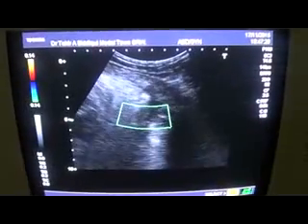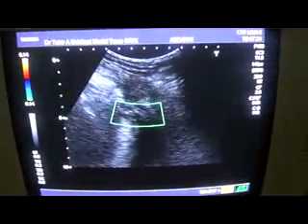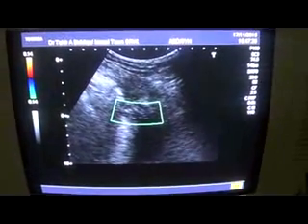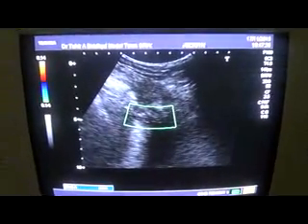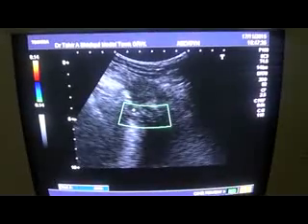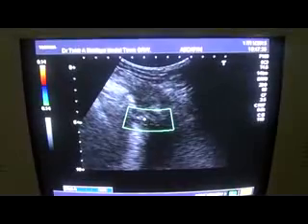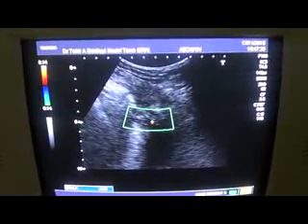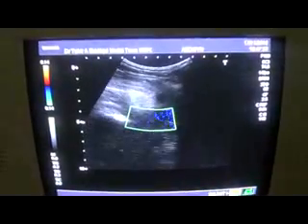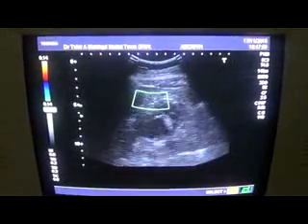We do not see any flow within these tubular structures, and thus this is in fact, again I am going to repeat, this tubular structure is the implanted ureter, and it is full of debris along with tiny calcification at its opening into the urinary bladder, and this is the cause of all the rest of the findings that we saw. I'm going to repeat it for you once again.